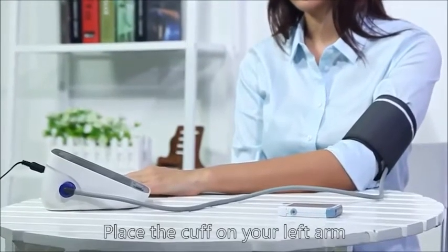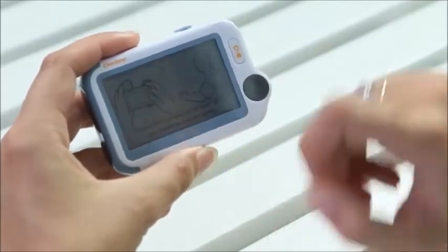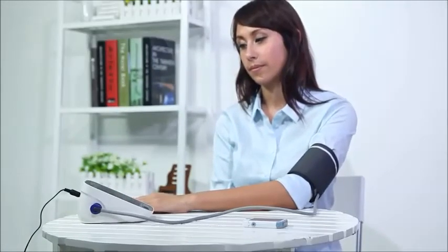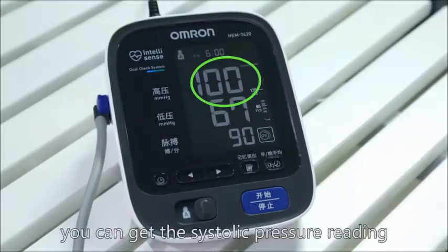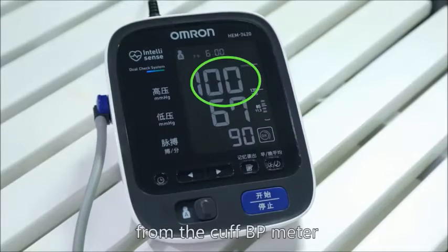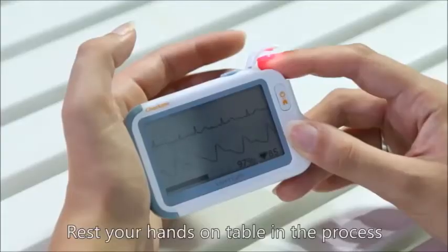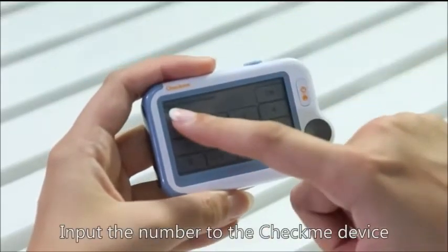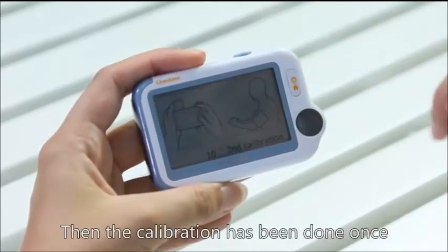Place the cuff on your left arm. Start the first calibration. Do the blood pressure measurement from the cuff BP meter first. After that, you can get the systolic pressure reading from the cuff BP meter. Remember the number. Then use the same posture as daily check. Rest your hands on a table in the process. Follow the tip, input the number to the CheckMe device. Then the calibration has been done once.